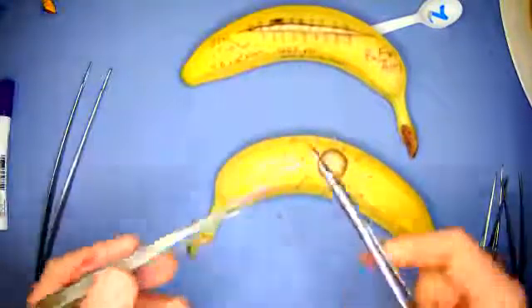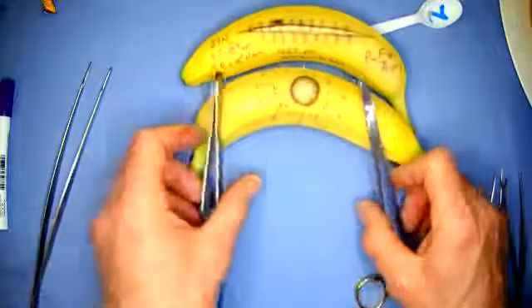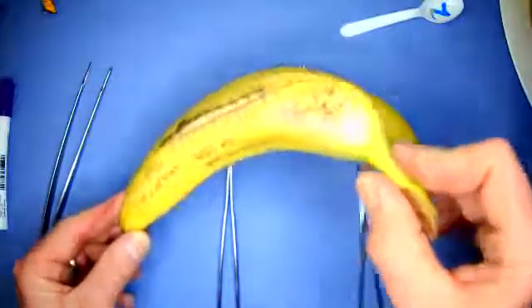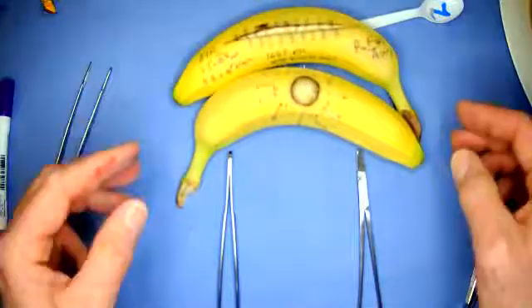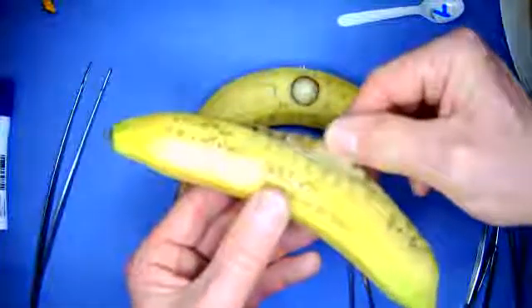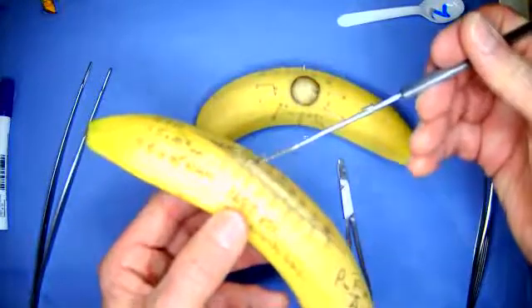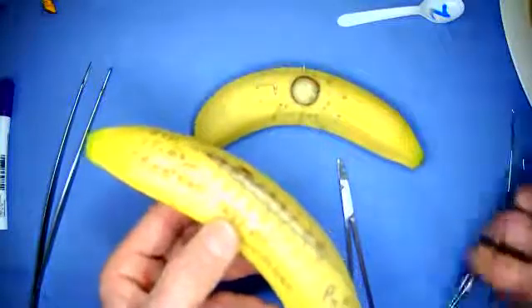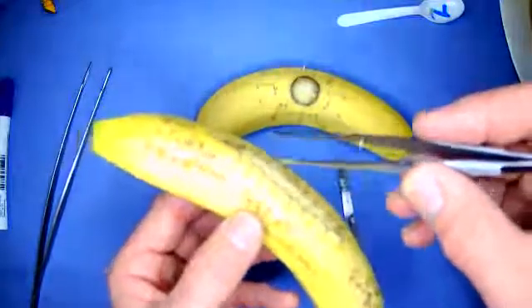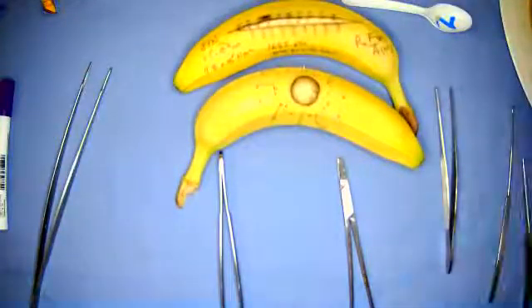And that's the whole thing. Your forceps, a bit like a knife and fork, should be complementing the action of one and the other. I do want you to remember that. I do want you to remember those equations and those numbers, because as I worked them out this evening before we went on, I was astounded. But actually, when you look at the result, I am not. And that's why most surgeons, when they close the skin, use a skin hook to reflect, or if you're using tooth forceps, just use the hook, one side, to lift and reflect. Never ever grab. And that applies to every single bit of tissue you're going to be operating on in the body.